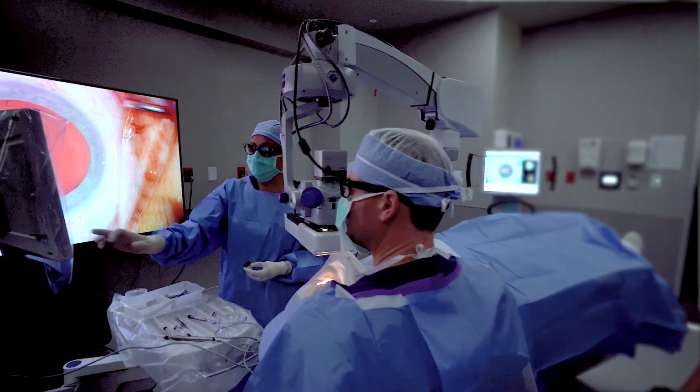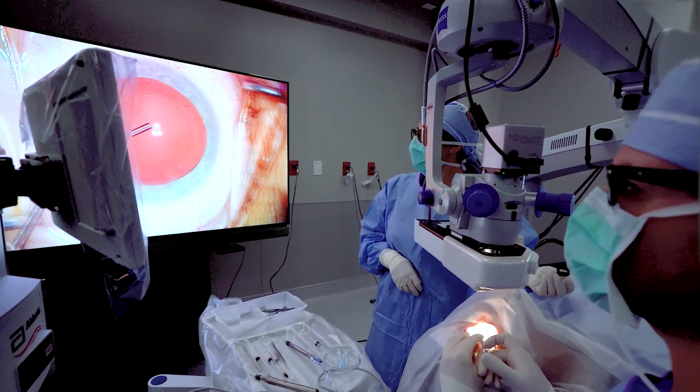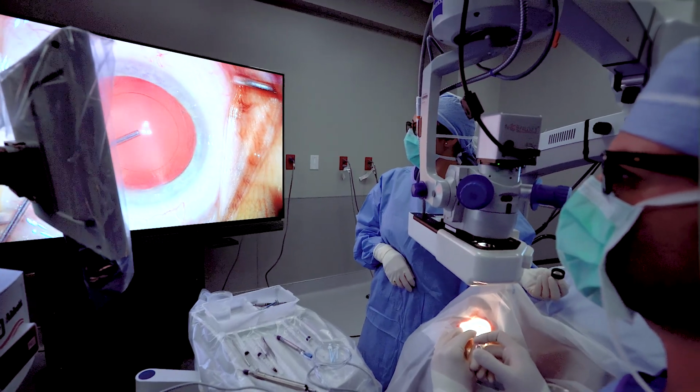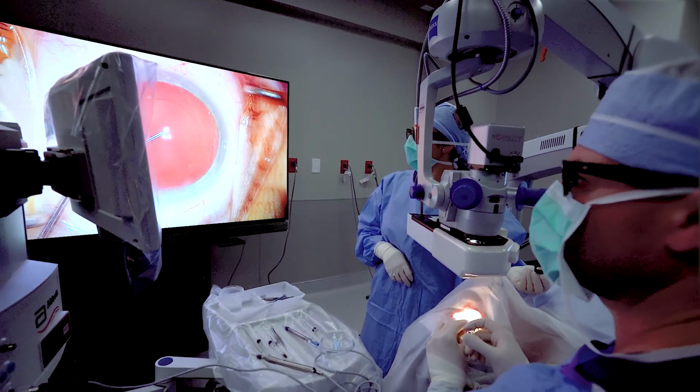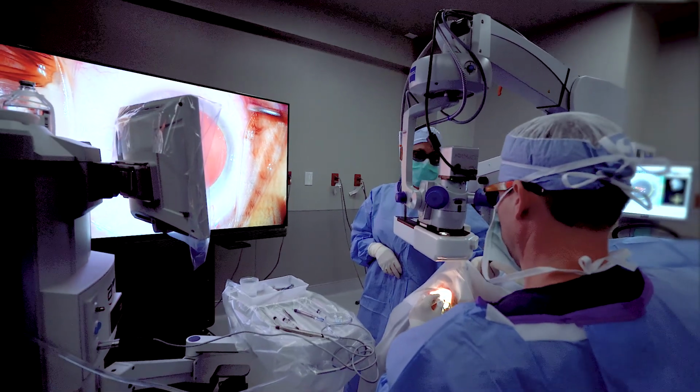What that means is there are several diagnostic machines out there. We use Pentacam, there's others that can do the same thing, OPD3, a couple others. That data is uploaded from my office workup directly to the LENSAR wirelessly. So what that means is I'm able to orient my axis of astigmatism placement, whether I'm using a toric IOL or an arcuate incision. I'm able to orient that axis of cylinder placement with iris registration, and that's really the key.